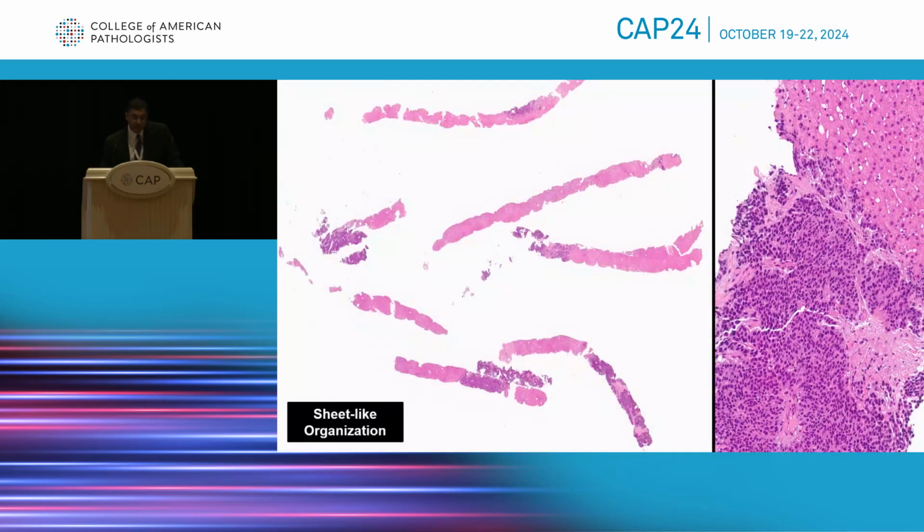And here's the FNB of the liver, and the same needles can be used not only for the pancreas, but they can use the same needles also to evaluate the liver itself, especially if it's close enough within the area of the EUS itself.